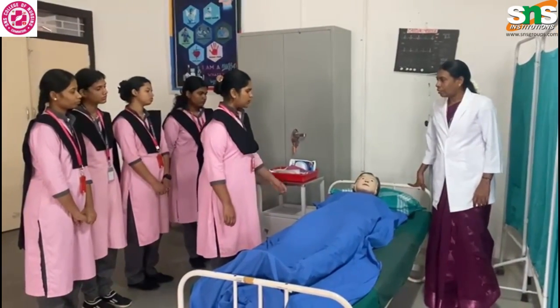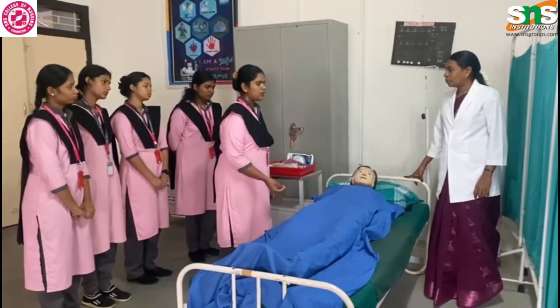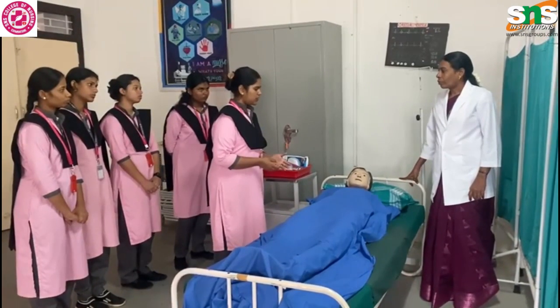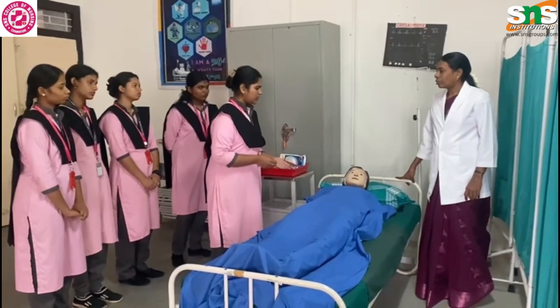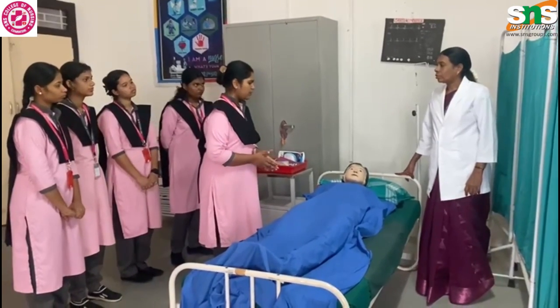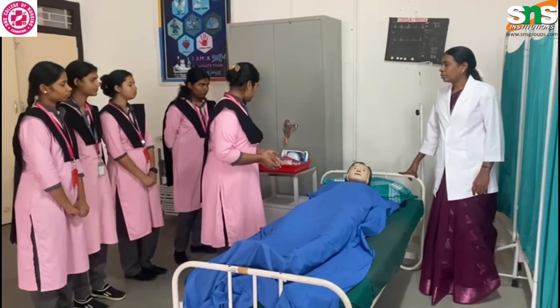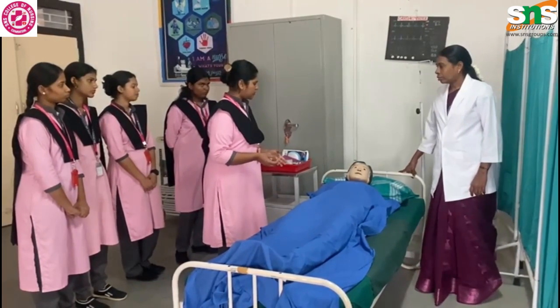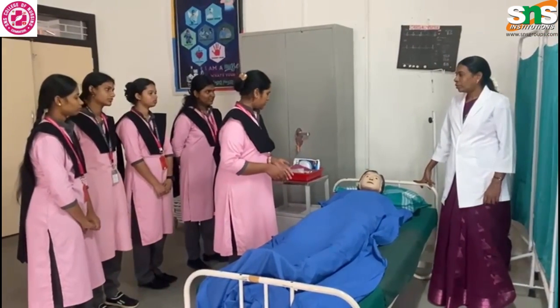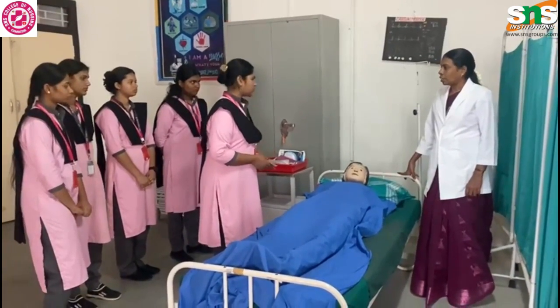Yes. Next. For inserting the tube, we have to apply some lubricant jelly on the tip of the tube and insert the NG tube. While inserting, we have to tell the patient to swallow the tube. If any discomfort is felt, we have to take the tube out. After insertion, you have to secure the tube by using the plaster. Yes.